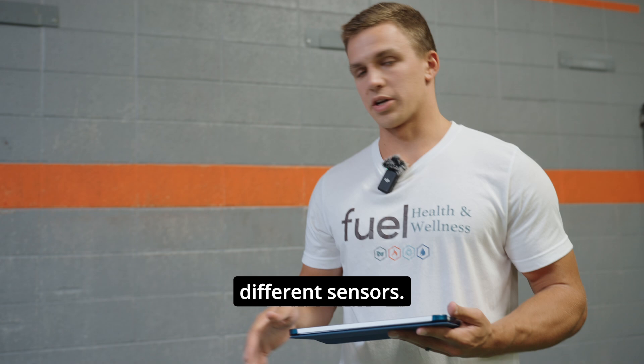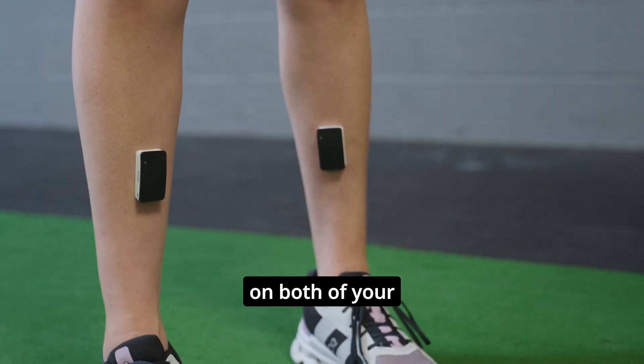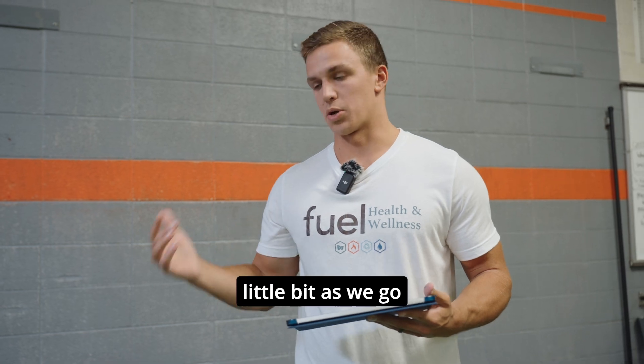So how it works is we have four different sensors. We rig you up with both of these two on both of your tibias and then a couple on your lower back. This helps to detect a bunch of different numbers that we'll go through here in a little bit as we go through the training.